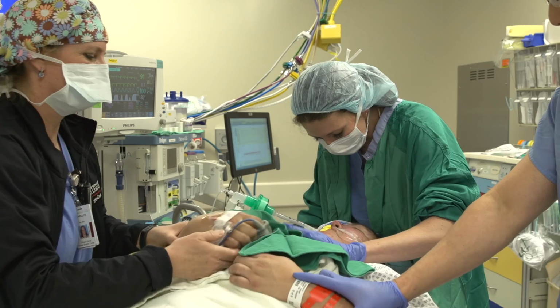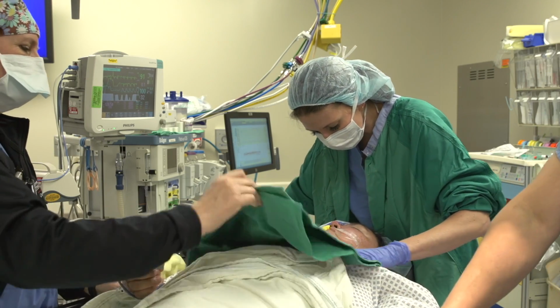Discontinuing ANEclear before the patient is completely awake can slow recovery. Monitor your patient for the classic signs of emergence from inhaled anesthesia and extubate based on your best clinical judgment.